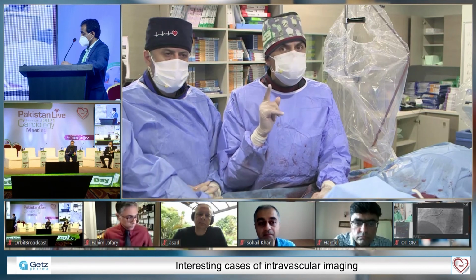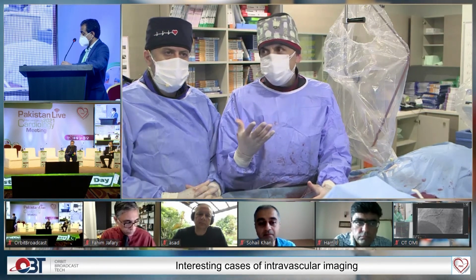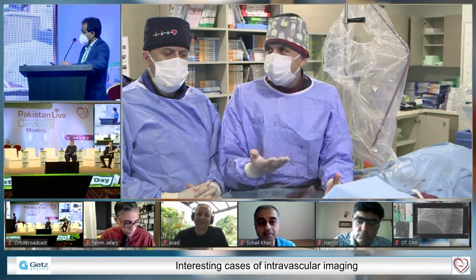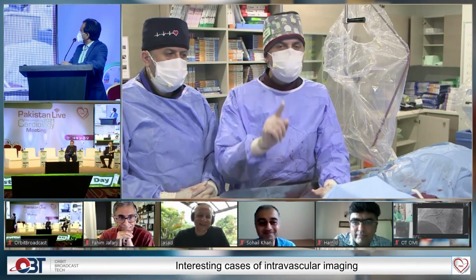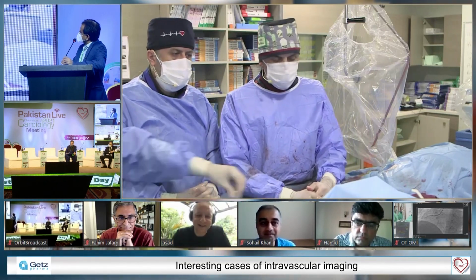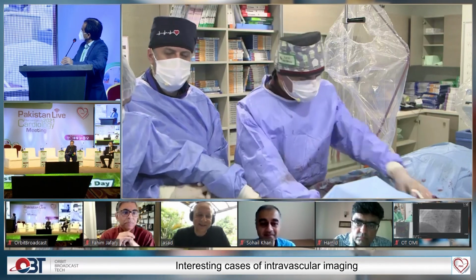And also, more importantly, we have to trust our tip injection. My tip injection shows nothing, right? But I still tried to do something. I shouldn't do that. I knew I shouldn't do that, but I did it. I did it in live transmission. I don't know how I did it, but I did it. So I think we have to trust tip injection. That's important. You have a great team, Omar. Yeah, that's true. But I trained them.